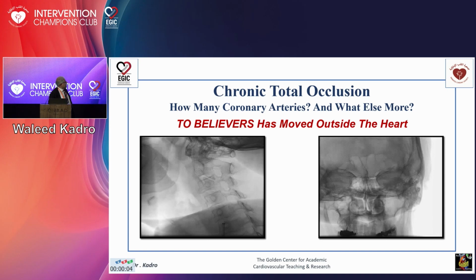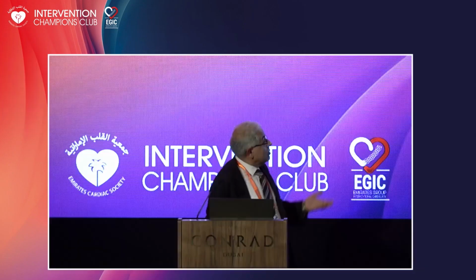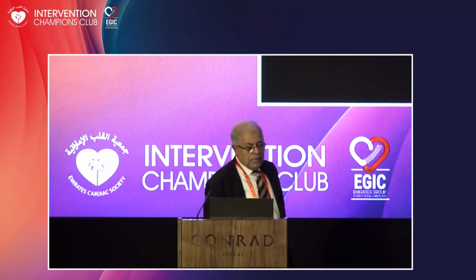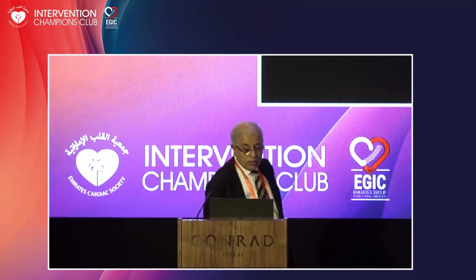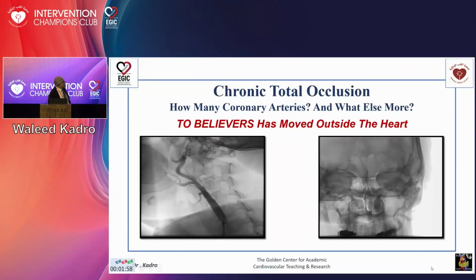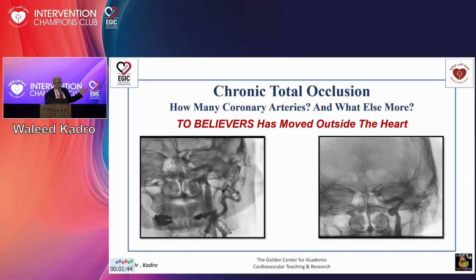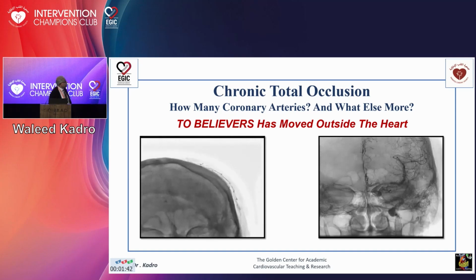This is a very rare case. You see the total occlusion in the internal carotid and nothing going to the brain, inside the brain. So just let me finish with that. So nothing going to the brain. It's total occlusion in the internal carotid, and with that we were able to open the internal carotid, and this is the angiogram. We got nice results, and everything is filling inside the brain.